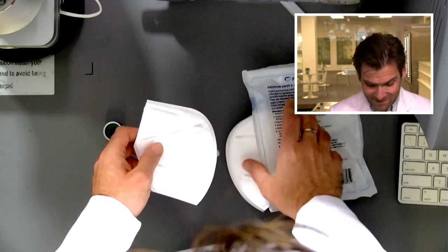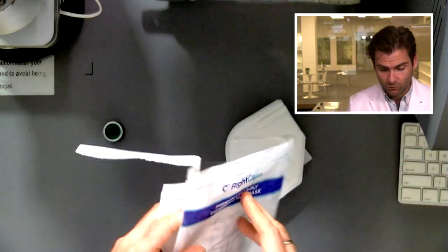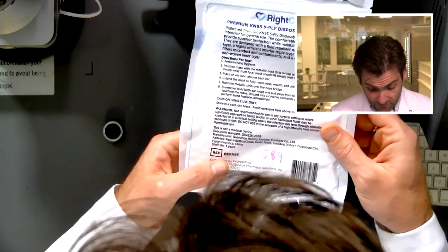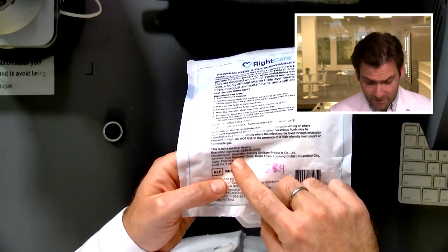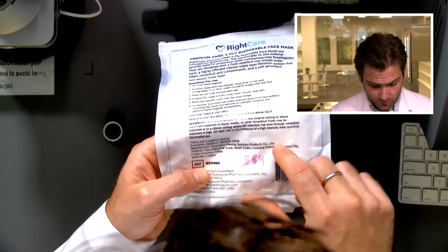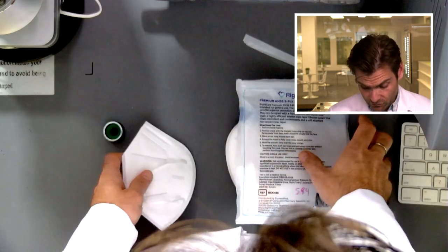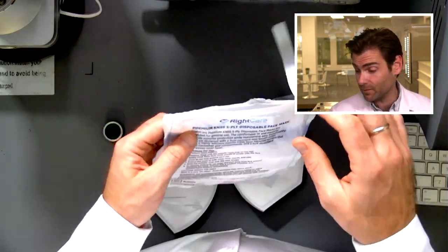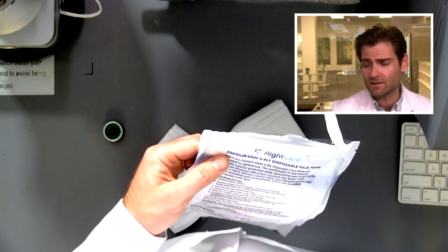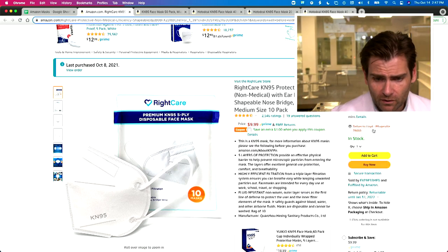The other thing they're missing is the name of the manufacturer. They're trying to sell this to you as Right Care, but that's probably not the manufacturer — in fact it's not. The manufacturer is Quanzo Hexing Sanitary Products Co. Limited. Any of those things printed on the mask would be beneficial and would make it a legitimate KN95 mask, as long as it also passed tests like this and about five other tests we're not going to do today. This is a great-looking brand — it looks like something you could find in Walgreens, not a terrible price.